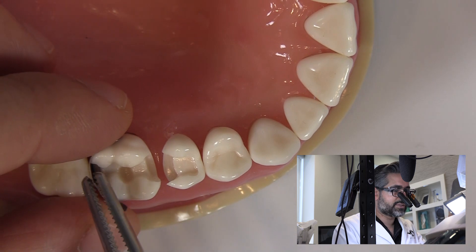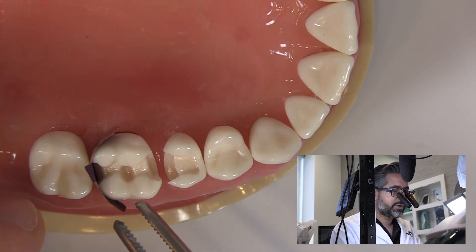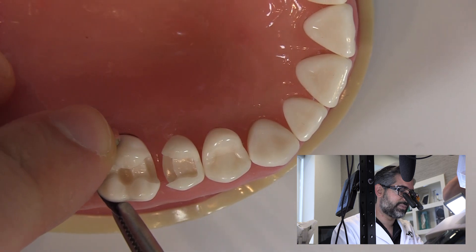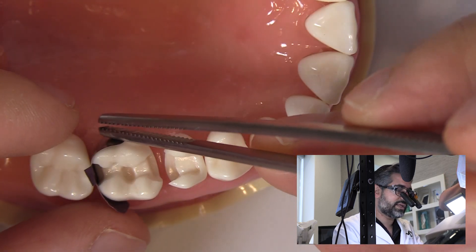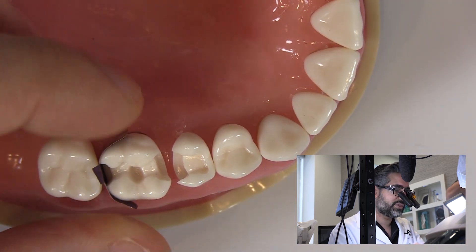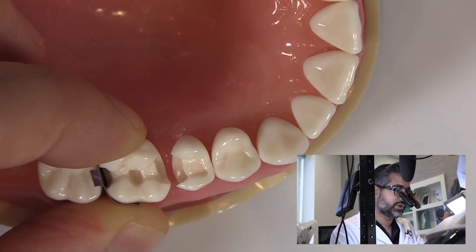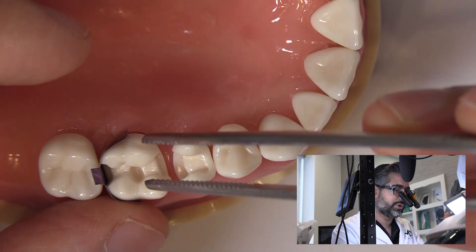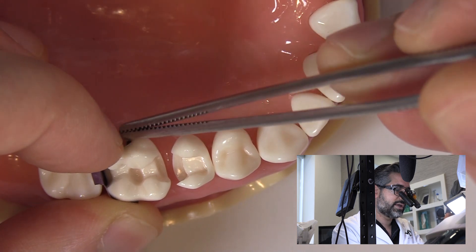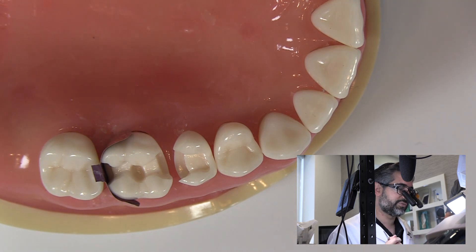Since I'm usually using isolation, one of the important steps here is to make sure I get between the rubber dam and the tooth margin. In order to do that, it's really important to either pull the dam out of the way, or when you get close, use another instrument to retract the dam lightly and get this matrix band between. Pre-curving a little bit like this helps a lot, but the number one thing that's helped me is assistance. My assistant can take this other side with cotton pliers or a composite instrument and help get that down between the dam and the tooth, and then it'll hold itself in place.